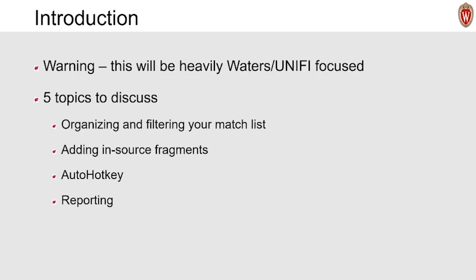Reporting. When reporting, we need a large report that contains everything about our run that we can use for discussion without the software present, like for open records requests. But we can also separate reports for resulting matches on samples, or a QC report to summarize how your quality controls are looking for a particular batch. We can then use that QC report to track QC material over time in something like Excel.